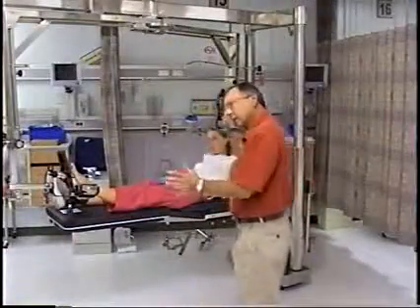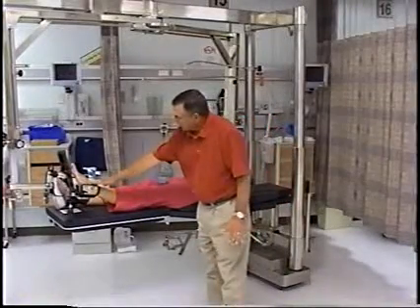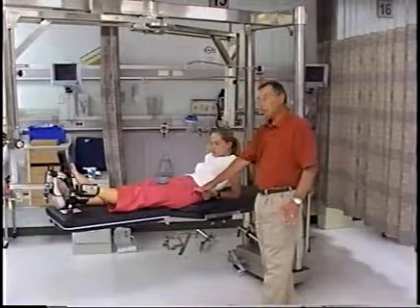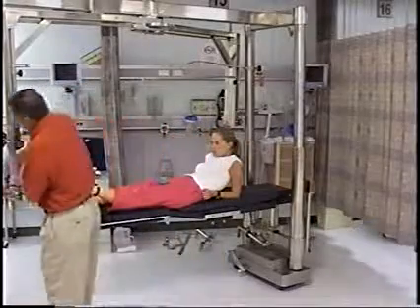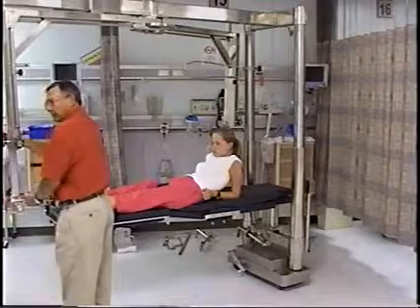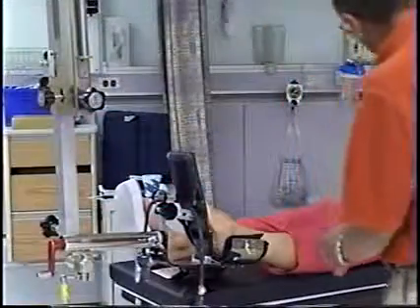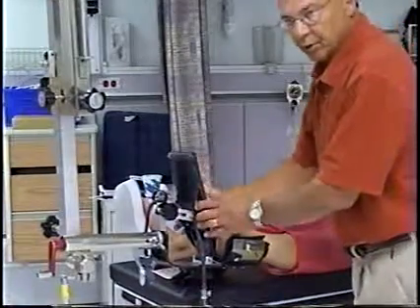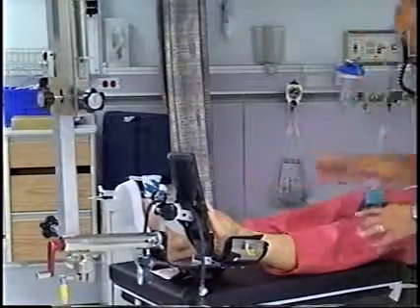With hip surgery, the doctor is going to want to keep the leg as anatomically parallel to the hip as he possibly can. So if it looks like it's going up, then we're simply going to lower this a little bit, so it's as level as possible. So now we've got a counter traction device, we've got a means to pull traction, but we've got to do something with this leg to get it out of the way.